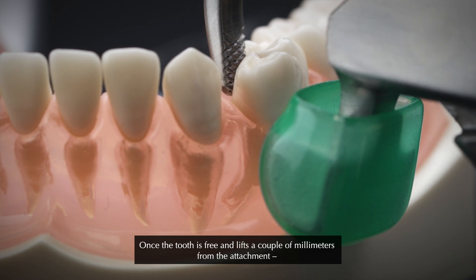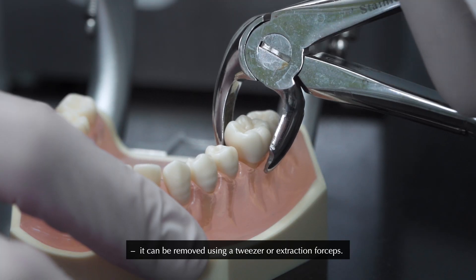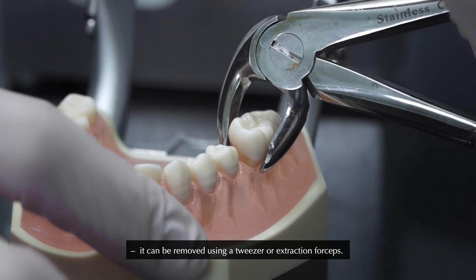Once the tooth is free and lifts a couple of millimetres from the attachment, it can be removed using a tweezer or extraction forceps.